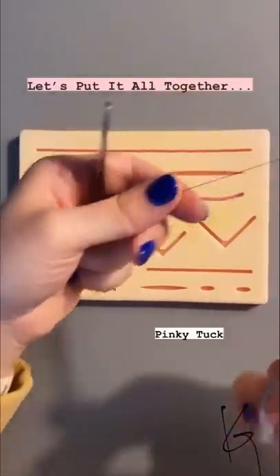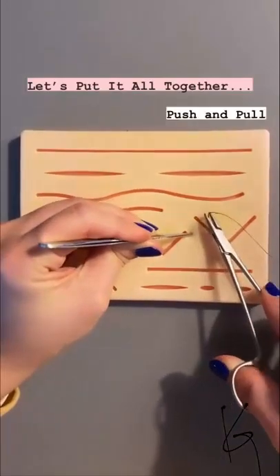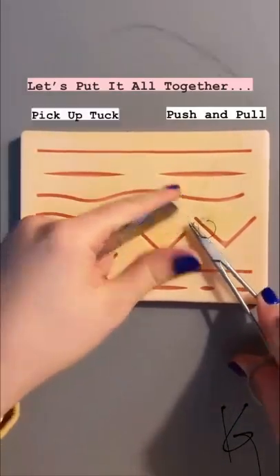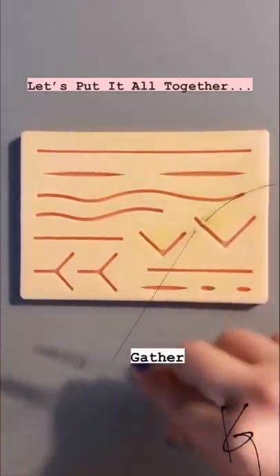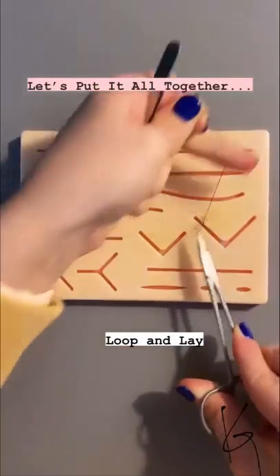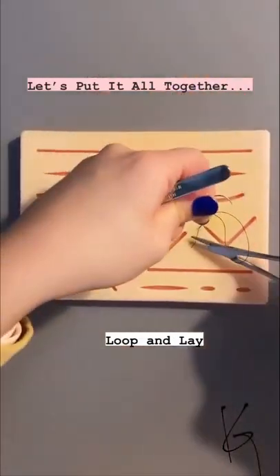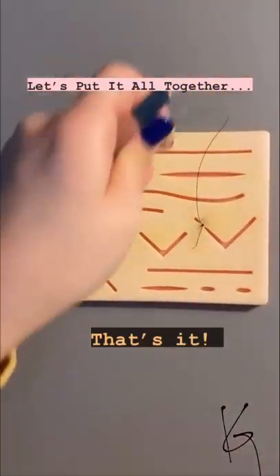Let's put this all together. We start off with the pinky tuck, go through the first part of the skin, through the second, do our push and pull technique, pick up and tuck the pickup in our left hand, gather in one simple step, loop, loop, and lay — repeat that two times with a single loop. And there we go, that's it!